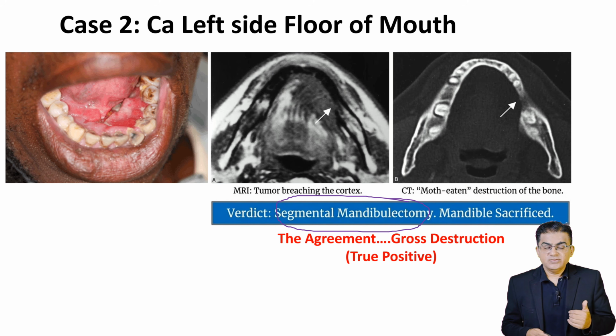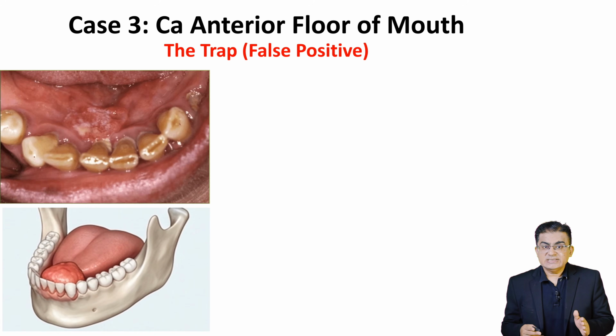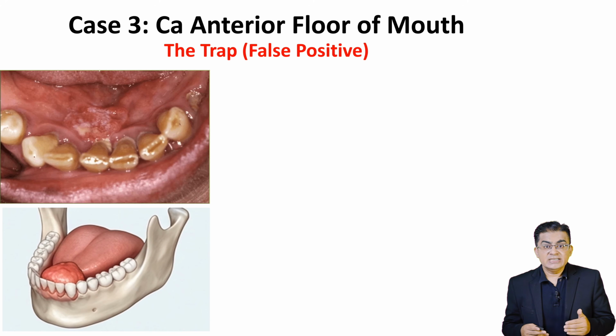So case 1 was easy. Case 2 was obvious. This is case 3. This is the real trap. Pay attention. This is the case that will try to trick you in your exams, and more importantly, it is the case that will keep you awake at night in the clinic.